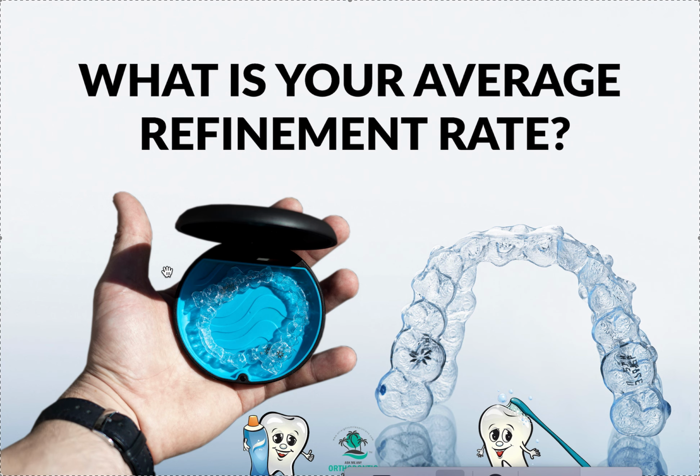And then the other thing you should be checking is the bite. It's even nice if you give them articulating paper and teach them how to use it, of course, tap, tap, tap. And then take your 5 intraoral photos. These are going to be biting down, front, side, top, bottom, as much as you can. I mean, it's not going to be perfect. It's not going to be orthodontic level photos. It's just rough photos so we can see what's going on.